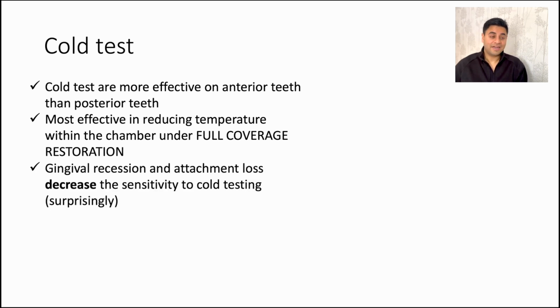Gingival recession and attachment loss decrease the sensitivity to cold testing, surprisingly. This is coming from a very common question asked in dental board exams. The topic they are trying to test you on is if the patient has gingival recession and attachment loss. You would think that since the gingival recession happened, when I apply the cold test, like my Endo Ice cotton pellet, the patient would definitely feel more response, because now the gums are gone.